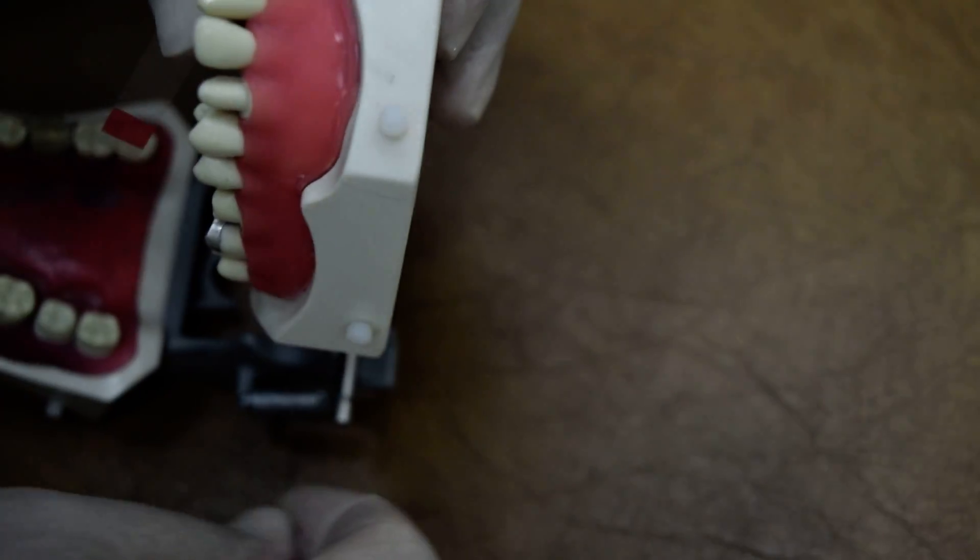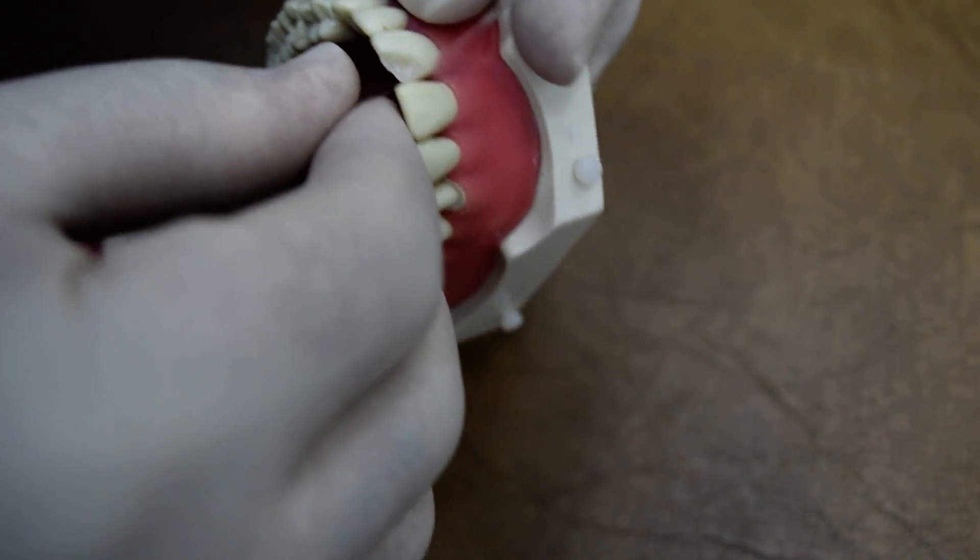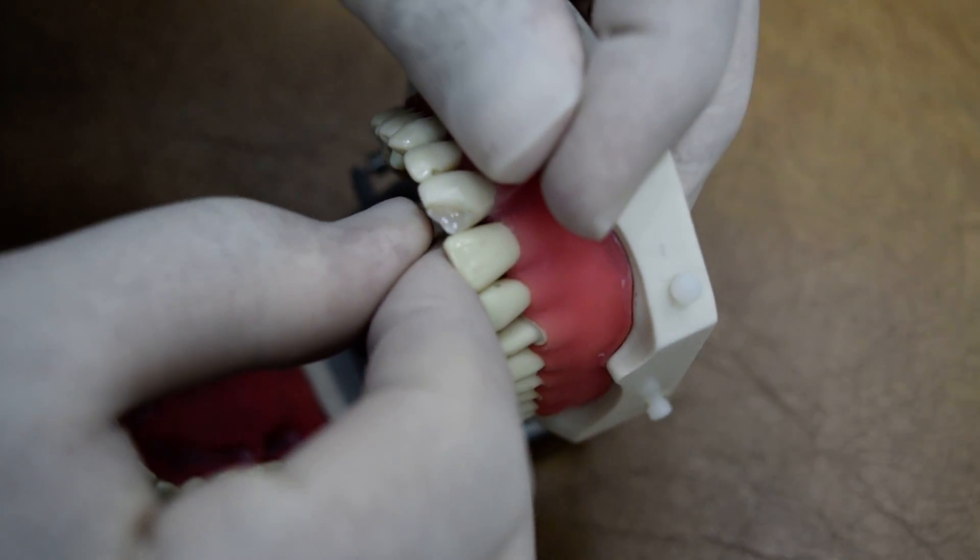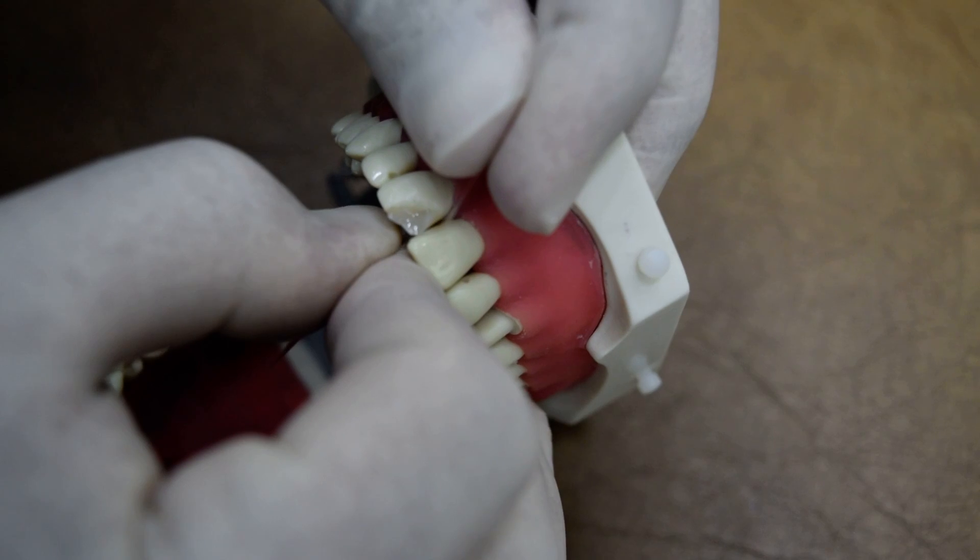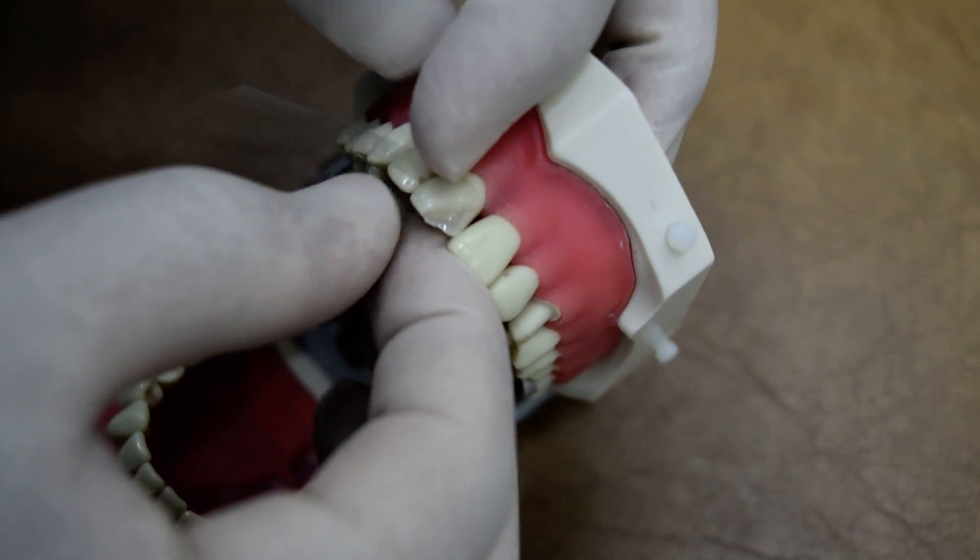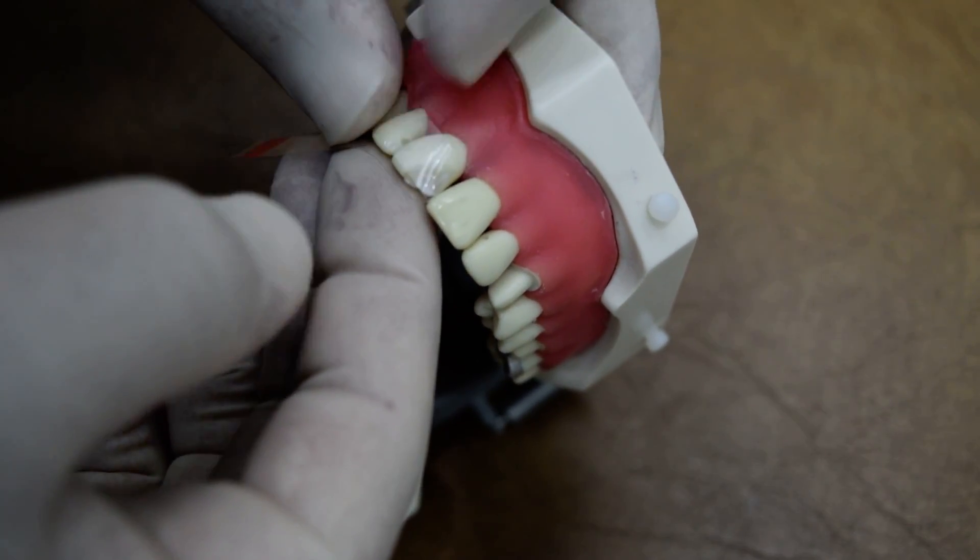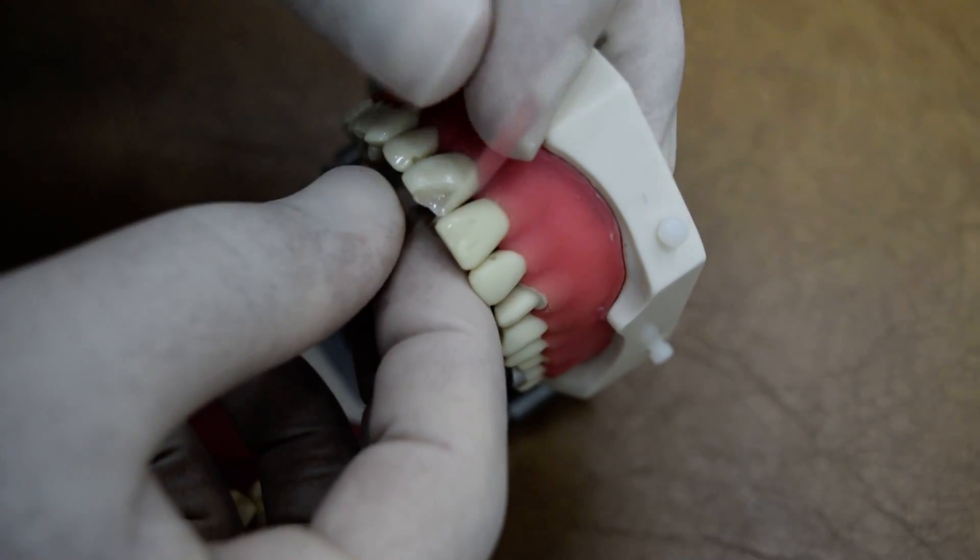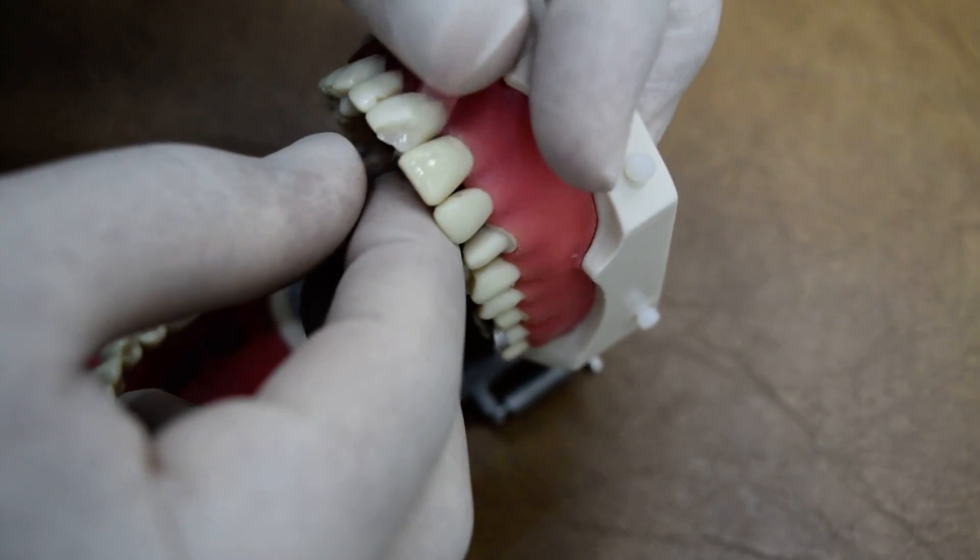Okay, so then we are going to remove the wedges and adjust the strip a little bit more incisally to accommodate the incisal surface and the labial surface.